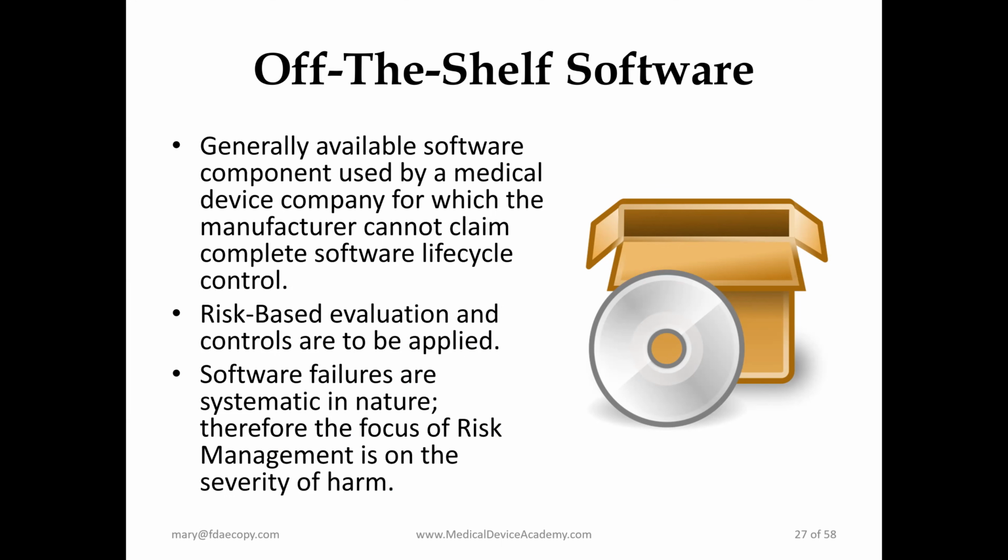Since software failures are systematic in nature and can't really be evaluated based on a probability, like you can sometimes do for design-related failures, the focus of risk management is mainly on the severity of harm. Next slide, please.